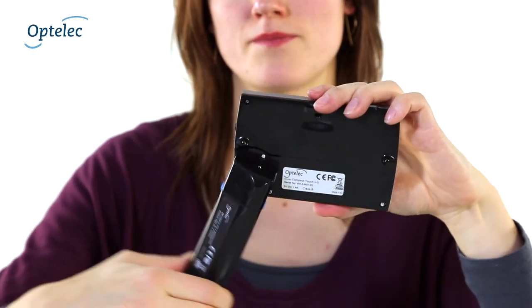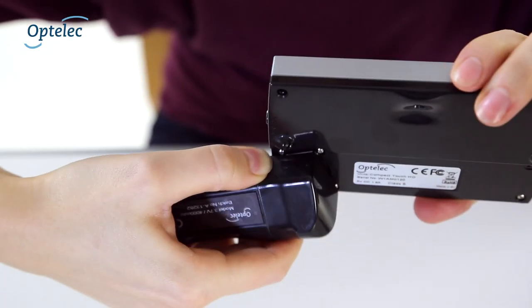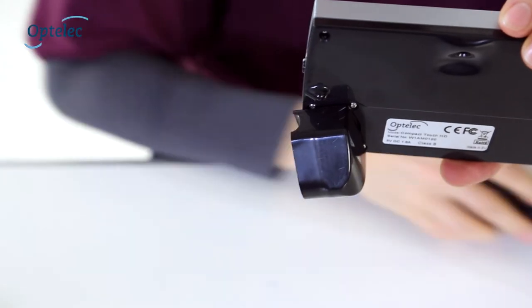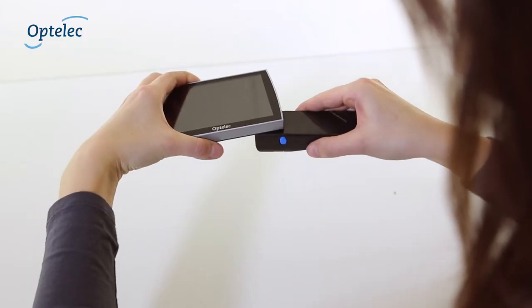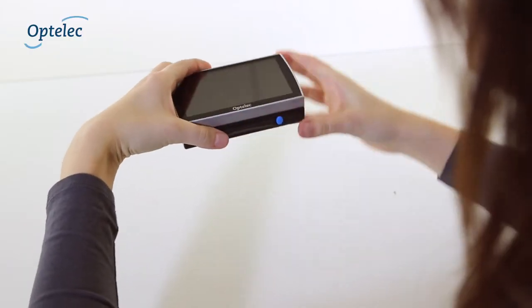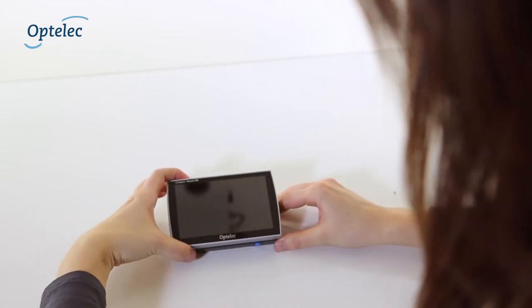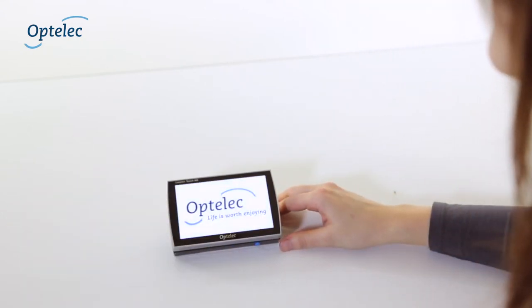The Compact Touch HD's built-in rechargeable battery handle is easy to replace. Push the two blue release buttons on the side of the handle and slide in an optional second handle. Now you can continue to use your Compact Touch HD while recharging your first battery.